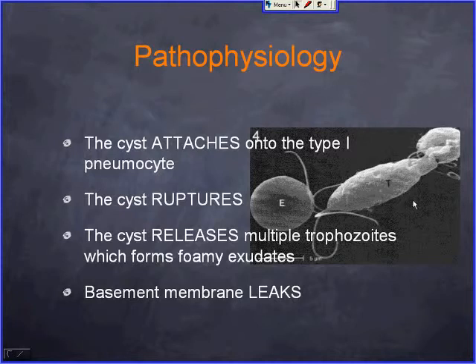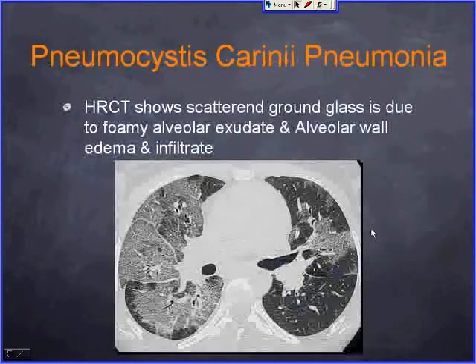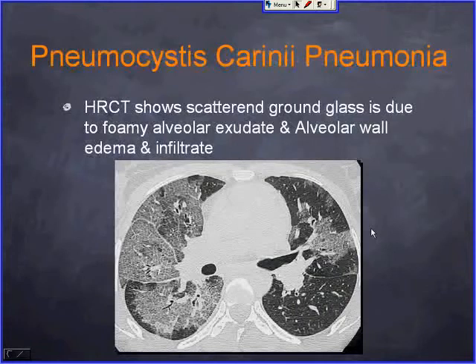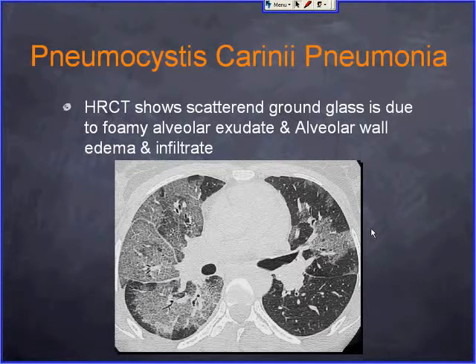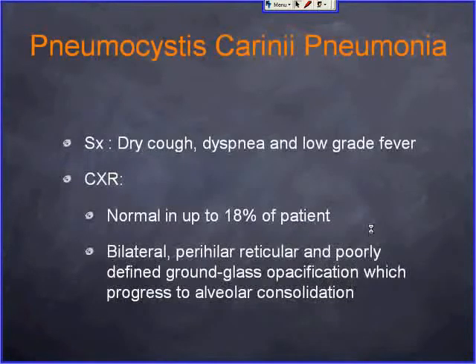On high-resolution CT you see scattered ground glass opacification, which is due to foamy alveolar exudates the trophozoites produce, along with interlobular and intralobular septal thickening from edema within the interstitium and inflammatory cell infiltrates. Patients usually present with dry cough, dyspnea, and low-grade fever.